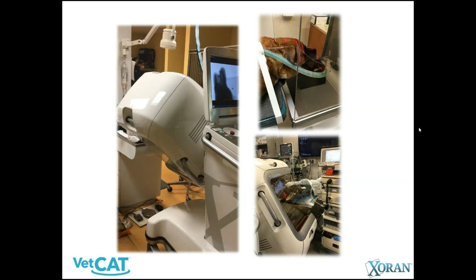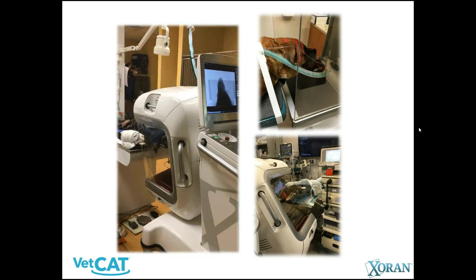Here's again the VetCAT in clinics. The patient is on the procedure table. When it's time to take a CT scan, the patient is positioned such that we can bring the machine around the head, and then we can spin the gantry around the patient.